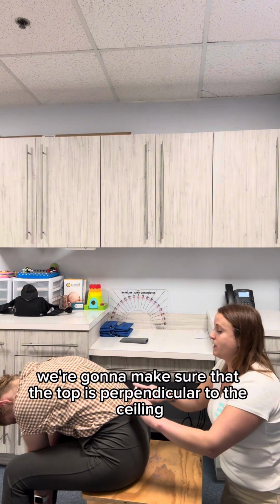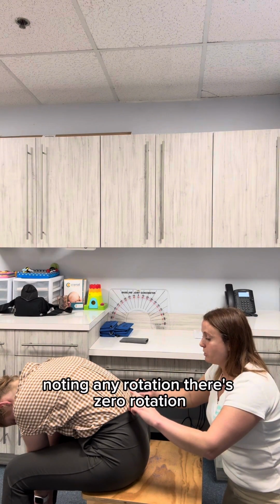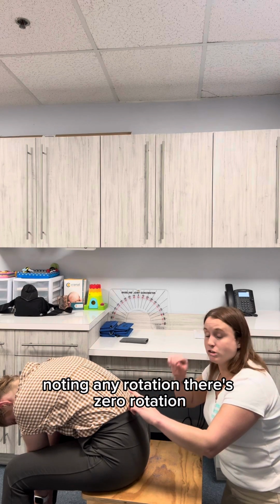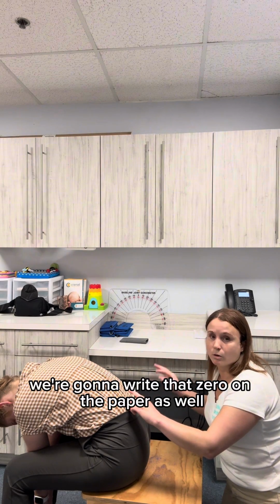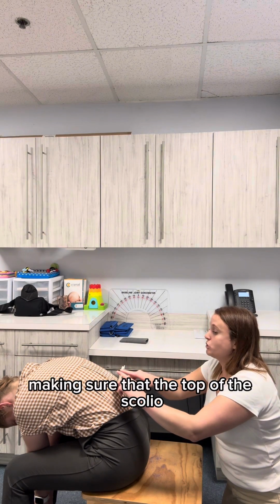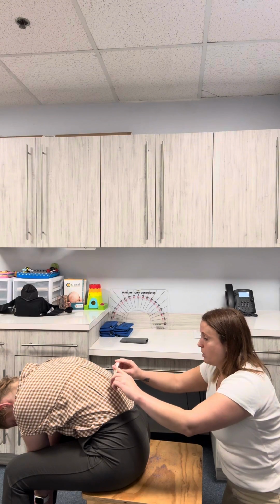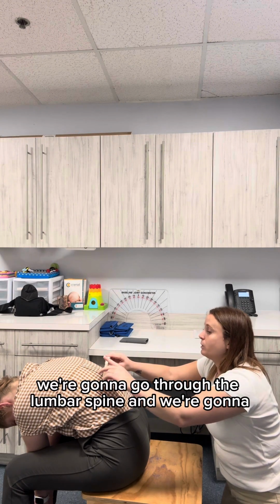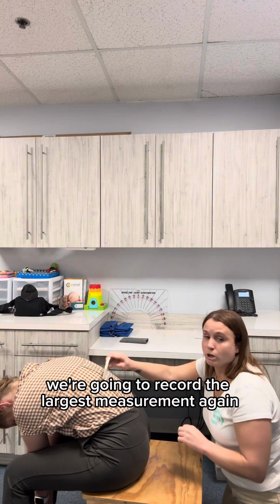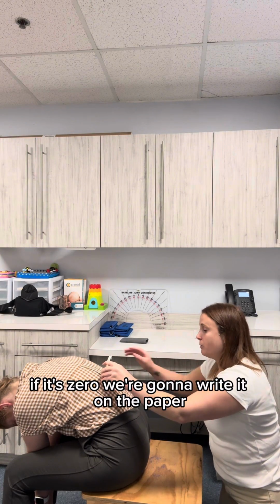I'm going to make sure that the top is perpendicular to the ceiling. We're going to take that measurement, noting any rotation. If there's 0 rotation, we're going to write that 0 on the paper as well. We're going to move up to the lumbar spine, making sure the top of the scoliometer stays perpendicular with the ceiling. We're going to go through the lumbar spine, and we're going to record the largest measurement. Again, if it's 0, we're going to write it on the paper.